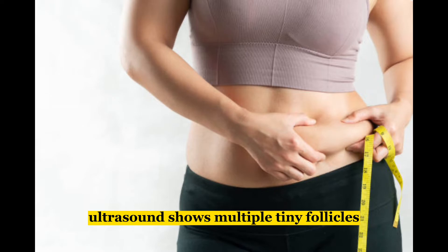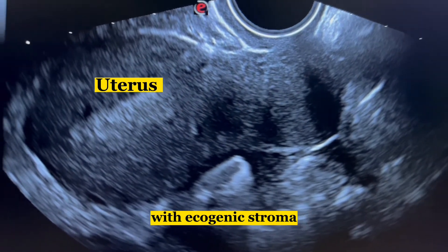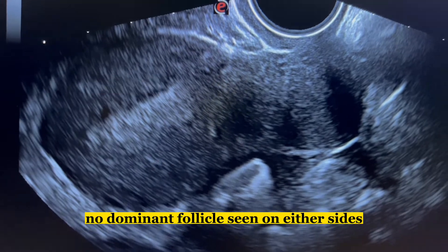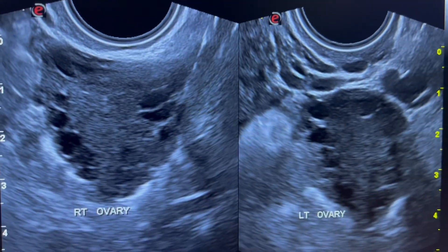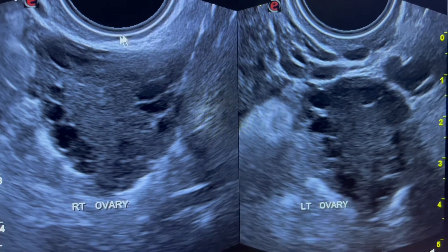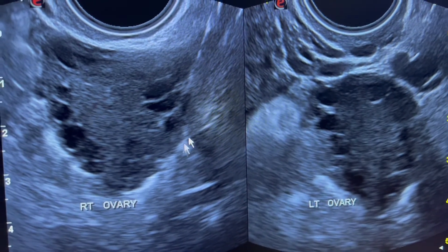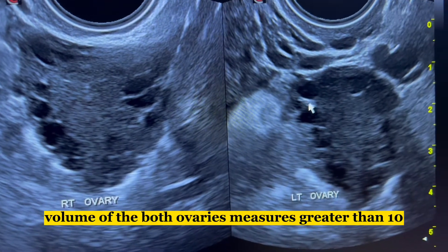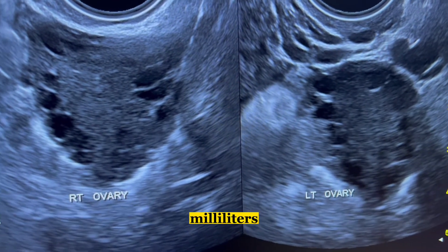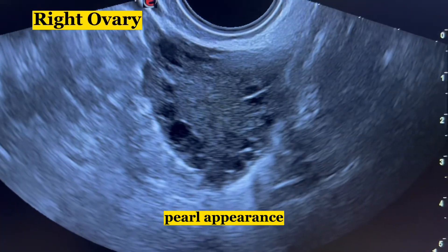Ultrasound shows multiple tiny follicles arranged around the periphery of the ovaries with echogenic stroma. No dominant follicle is seen on either side. The volume of both ovaries measures greater than 10 milliliters. The peripherally arranged follicles give a string of pearl appearance.